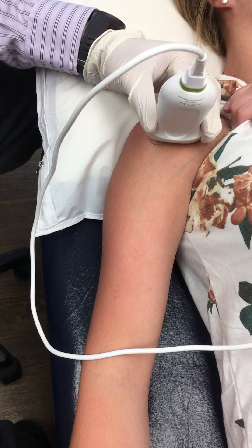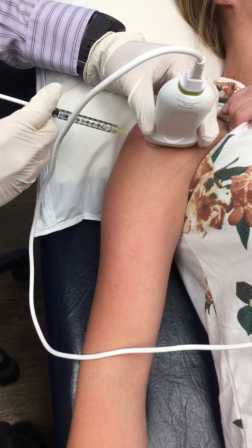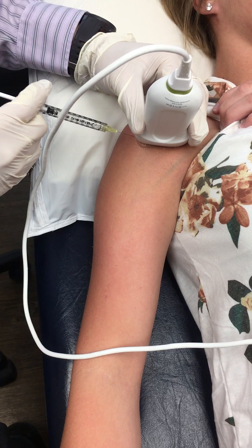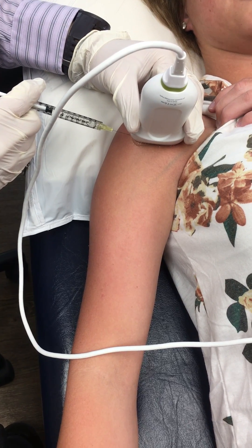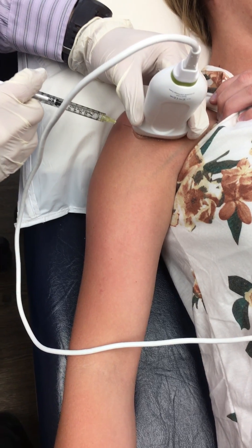So I'm gonna do a little tiny local anesthetic. Ready? One, two, three — poke. So this is lidocaine. Lidocaine kind of stings. Does that burn much? A little bit — it just kind of tickles. I'll try not to tickle you too much.